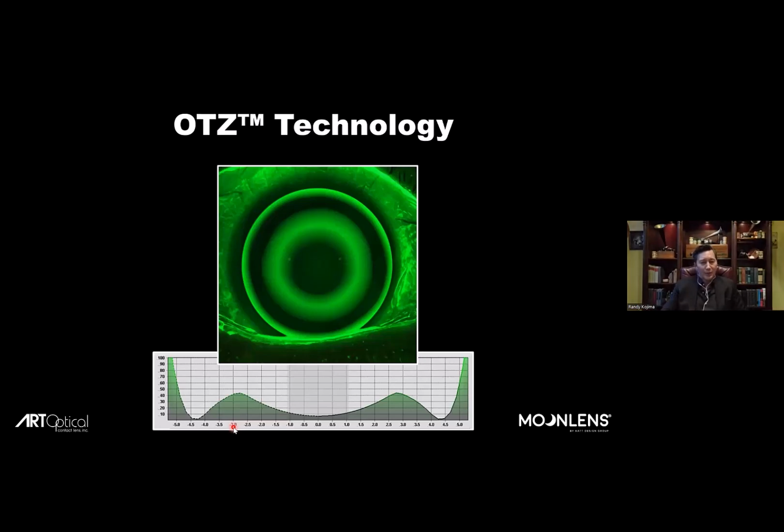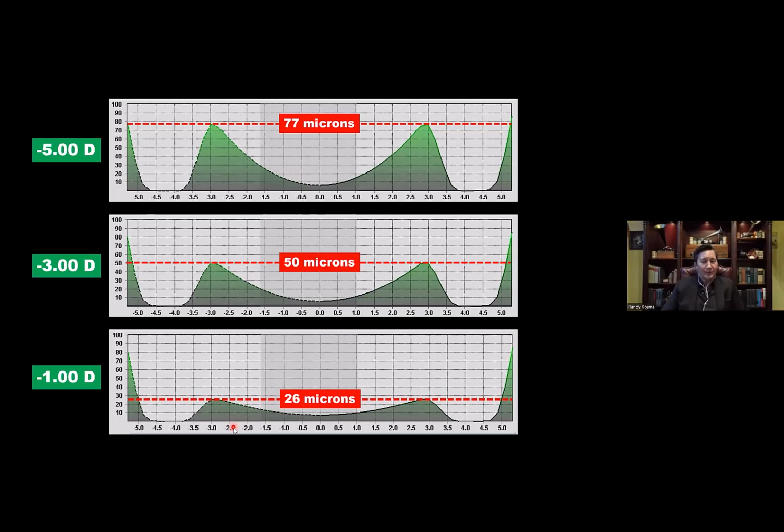Now, to understand some of these tear forces, it's kind of helpful to look at these tear profile graphs. And if you fit a patient with a one diopter myopia, or you want to create a 1 diopter reduction in myopia, 1 diopter flattening of the central cornea, this is the fluid layer that would be calculated to create that effect.